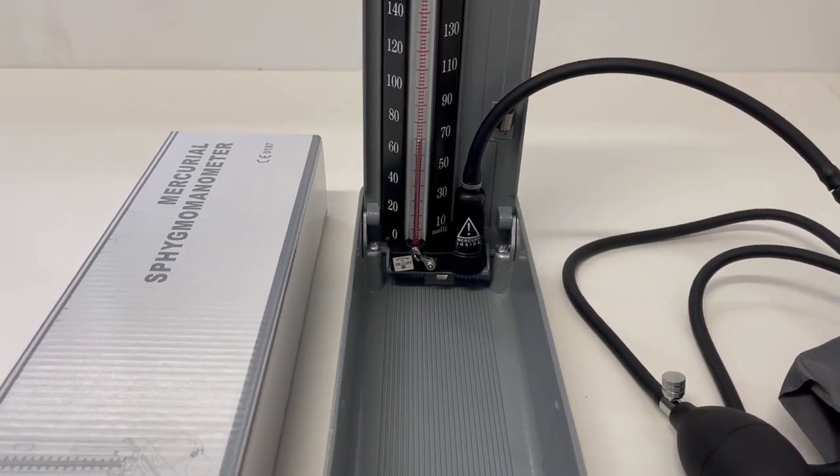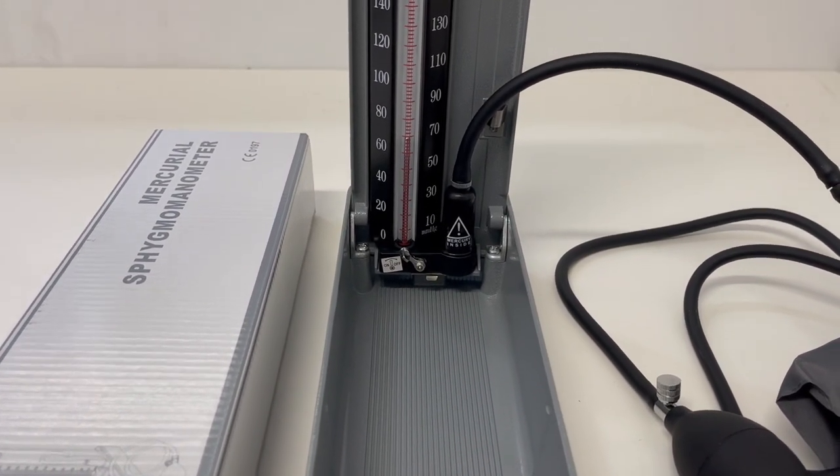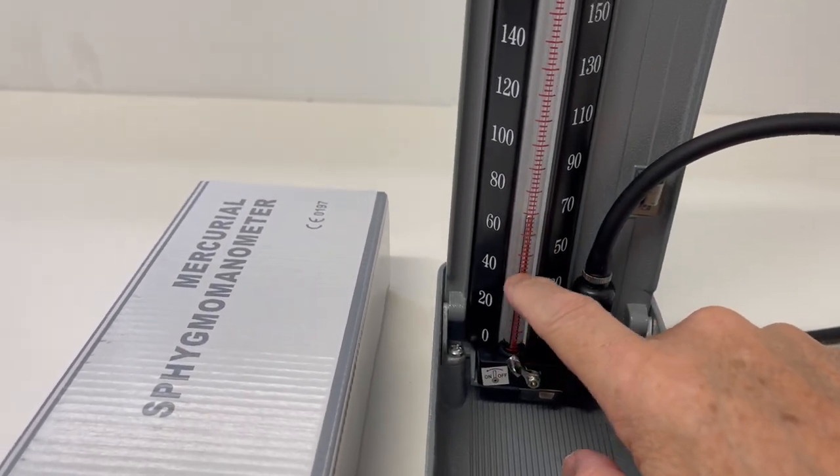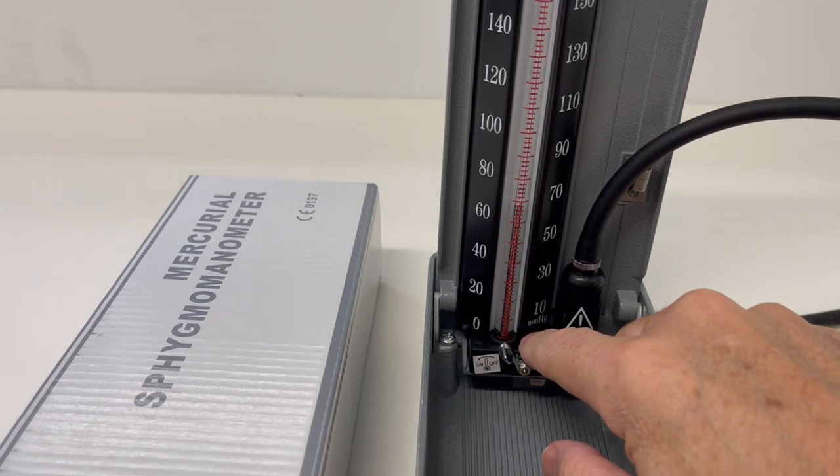If you've recently purchased one of these mercury sphygmomanometers and you find that there is actually a gap in the mercury, there is a way to fix that.